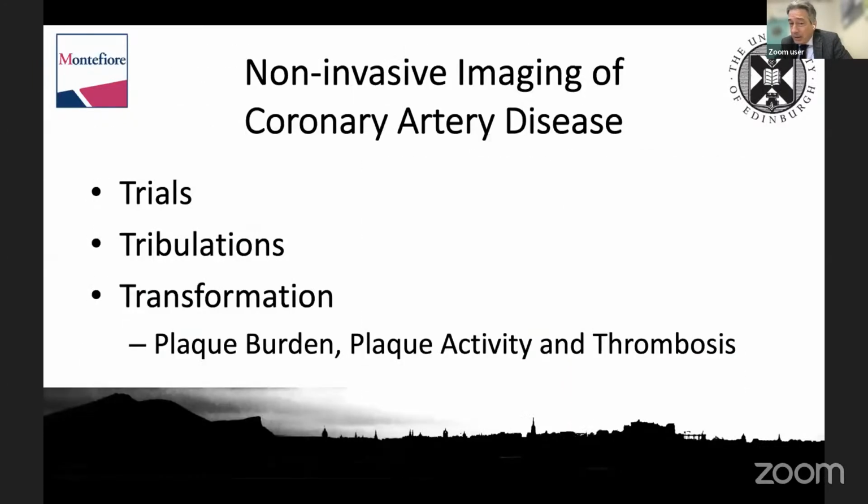So I think that sort of technique might be useful perhaps in MINOCA patients. We're not quite sure whether it's thrombotically caused or not, but certainly it's something that I think we're increasingly starting to use both in myocardial infarction, but also in stroke of uncertain origin.